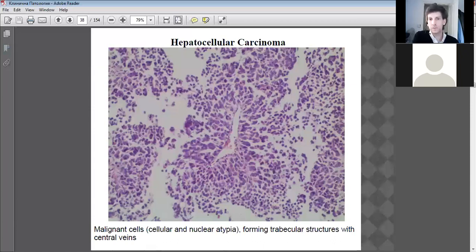Here's an example of a collapsed structure there. Okay, we had our example of a vein. This is a collapsed, like trabecular structure. It looks like a trabecular structure. It could also be associated with some blood vessels as well, because I can see some examples of capillary red blood cells or erythrocytes.